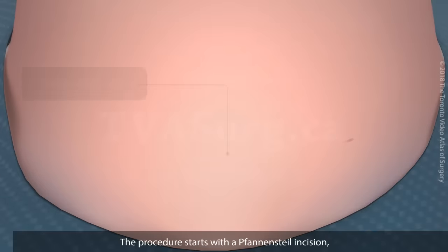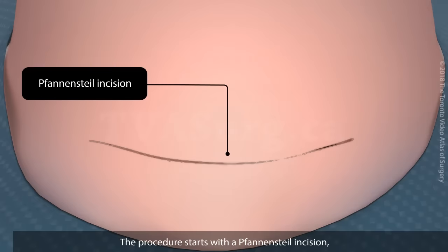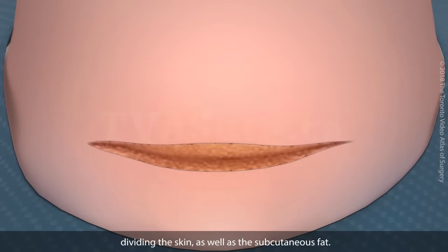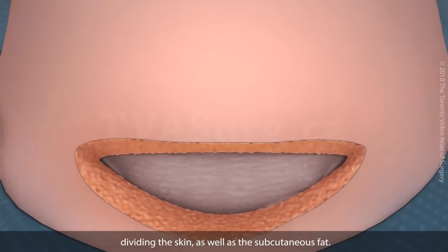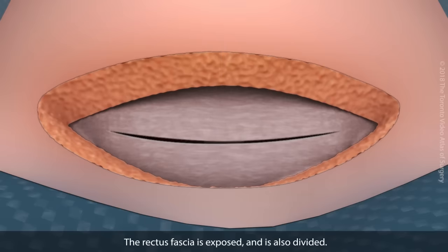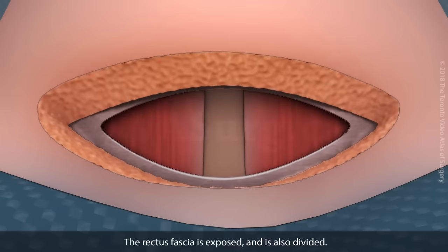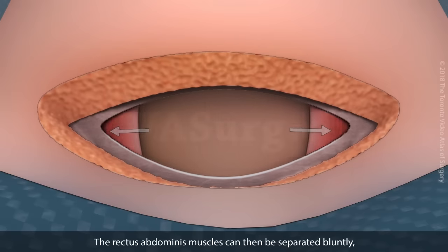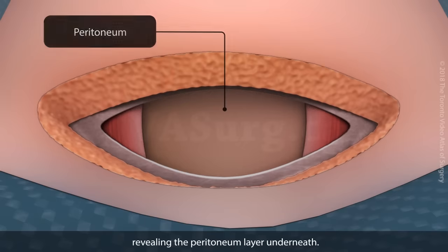The procedure starts with a Pfannenstiel incision, dividing the skin as well as the subcutaneous fat. The rectus fascia is exposed and is also divided. The rectus abdominis muscles can then be separated bluntly, revealing the peritoneum layer underneath.